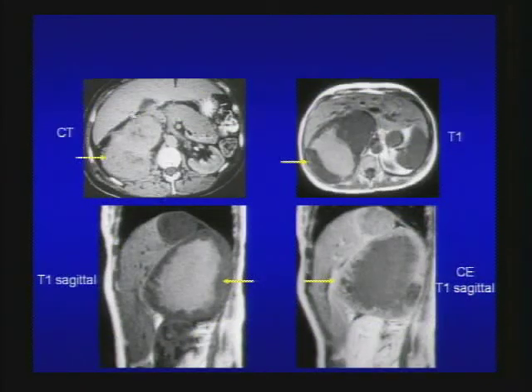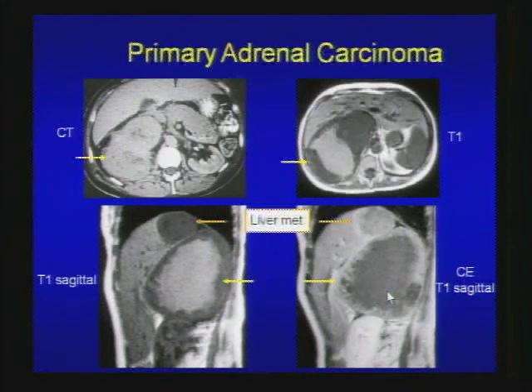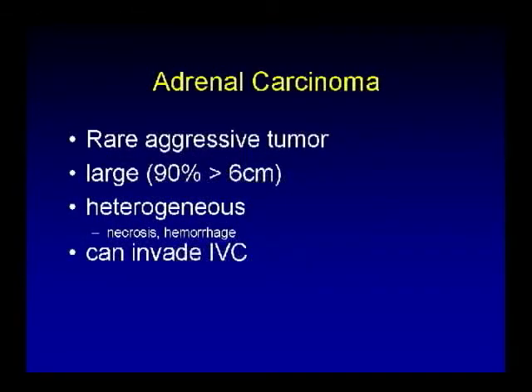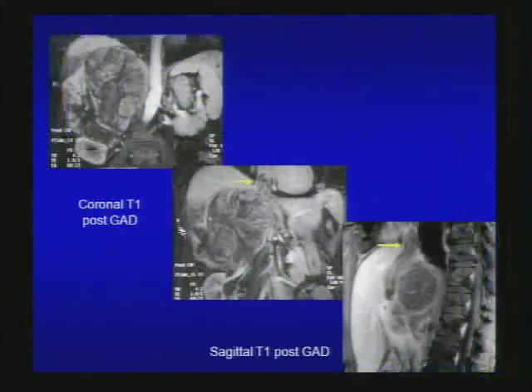Now here's a case of a large right suprarenal mass, very heterogeneous on CT and T1-weighted image. On post-gadolinium T1 sagittal image, you see irregular peripheral enhancement and central necrosis — looks like a very aggressive tumor. This is adrenal cortical carcinoma. Did you notice the liver metastasis? Adrenal carcinoma is a very rare, aggressive tumor, usually large at presentation, heterogeneous because of hemorrhage or necrosis, and has a propensity to invade the IVC. Here's a CT case in a woman with right upper quadrant pain and a large right adrenal mass — on MR you see the tumor thrombus extending into the IVC.